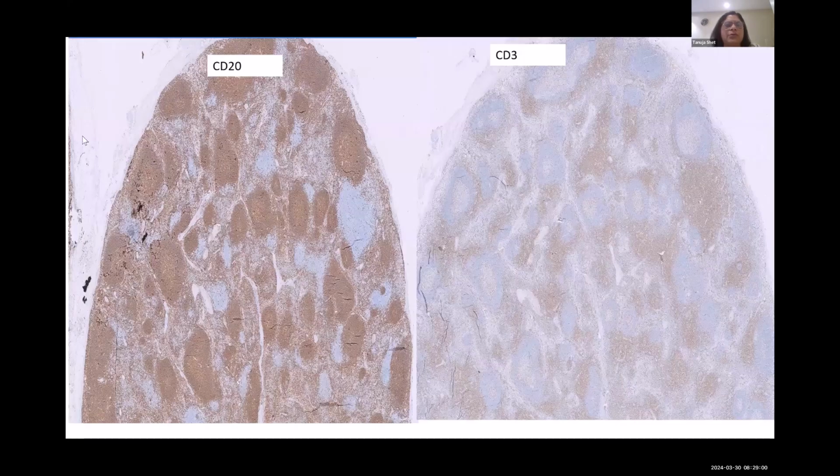So now let's look at the immunohistochemistry in the node. As I said, traffic control. B cells in a normal reactive node are concentrated around the germinal centers, the mantle cells, and you'll always see some scattered B cells in the paracortex. This is the paracortex. Normally the paracortex is between the germinal centers, but here you can see that it is tangentially cut.